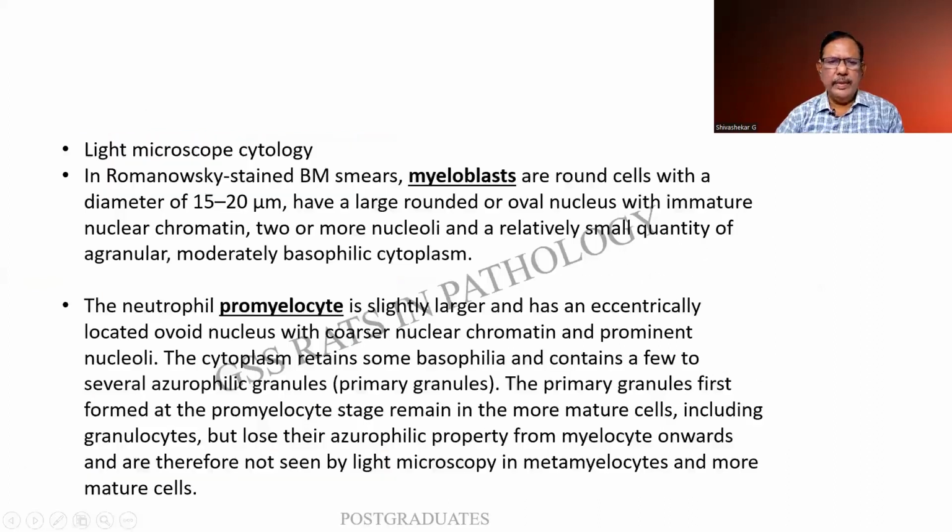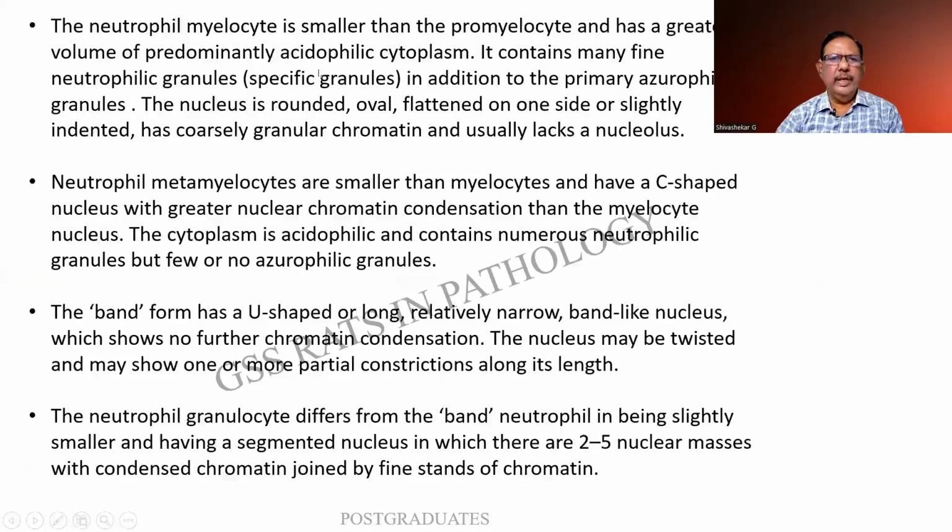This one I have explained already. I would like you to kindly go through it. The myeloblast, the promyelocyte, as well as the other cells.